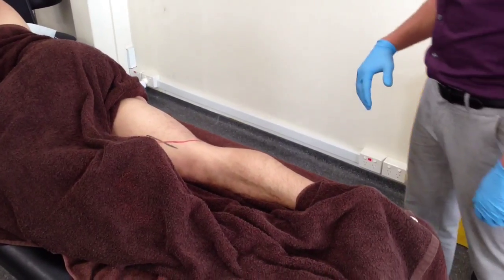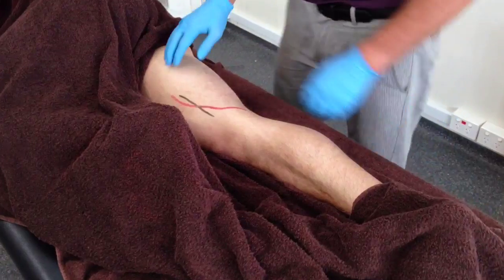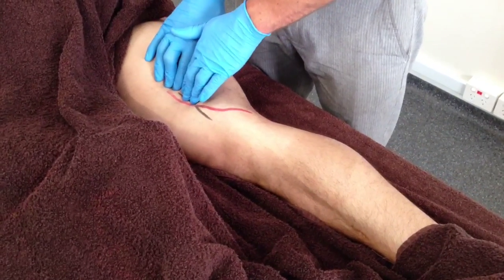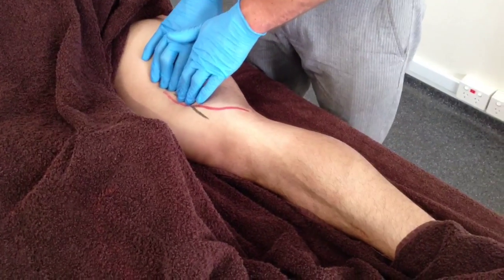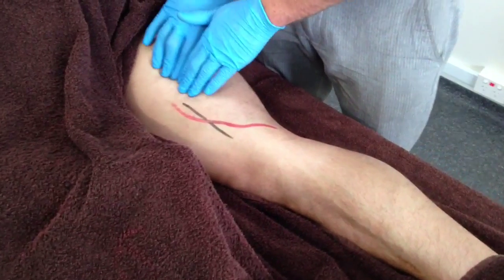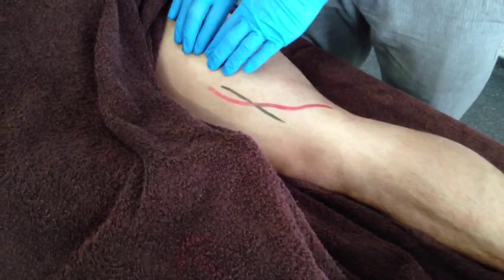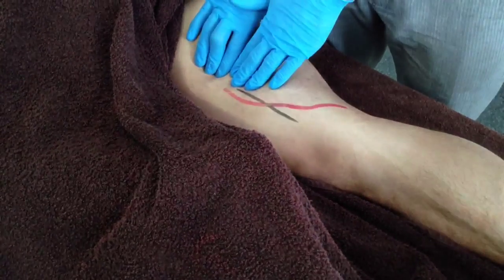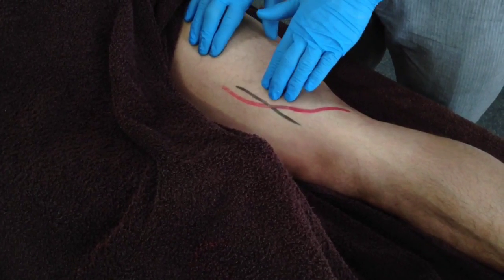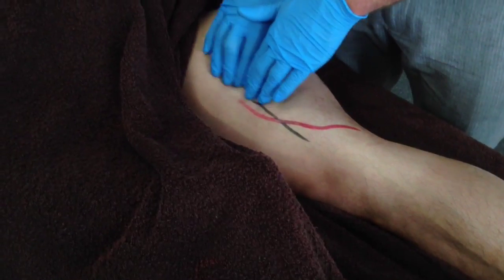With the patient in a side-lying and supported position, the unaffected leg is positioned to expose the medial aspect of the affected leg. The presence of trigger point taut bands can be palpated for above the area of the adductor hiatus that forms the conduit for the femoral vein and artery to enter, leaving as the popliteal vein and artery. This is indicated here as the red vessel crosses the black line.